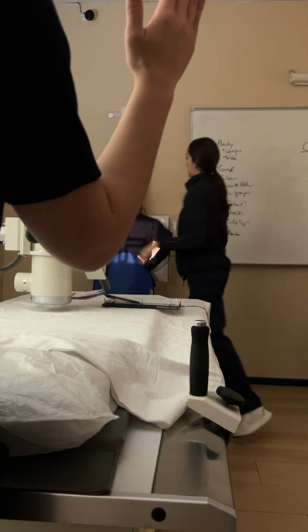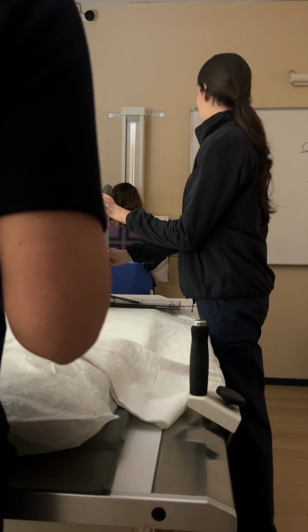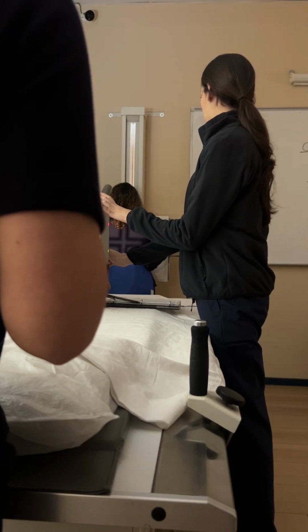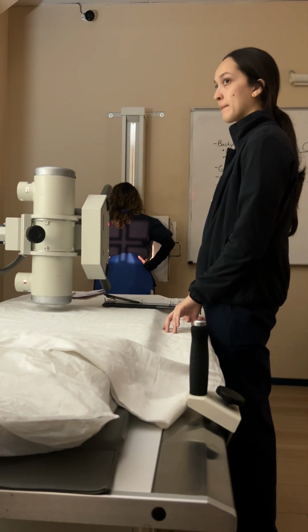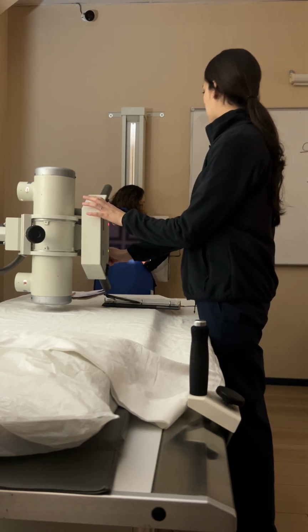And then you want to collimate in because I see a lot that's not in her chest. No, open. You don't want to collimate too tightly because you don't want to cut something off and then have to repeat the image. So a little bit extra won't kill the patient.